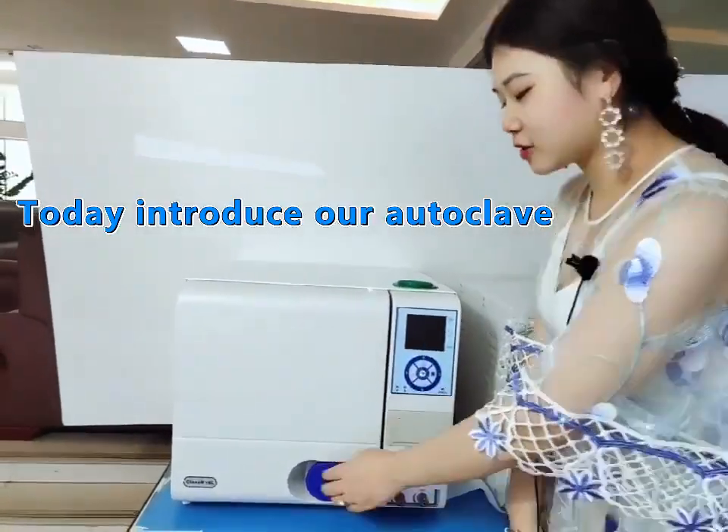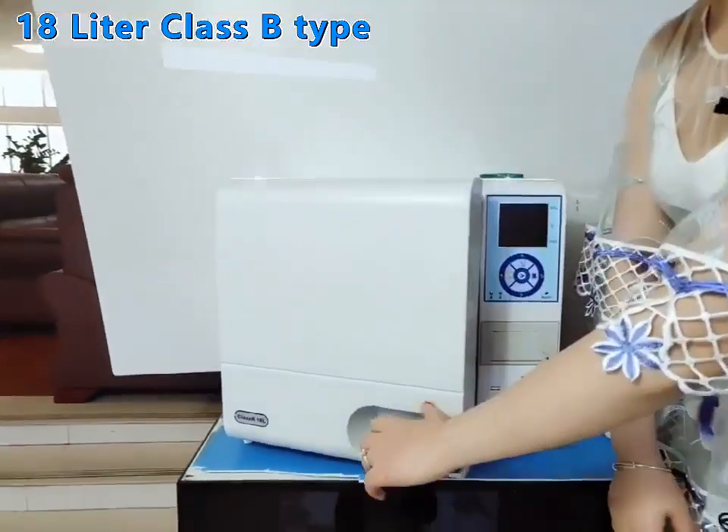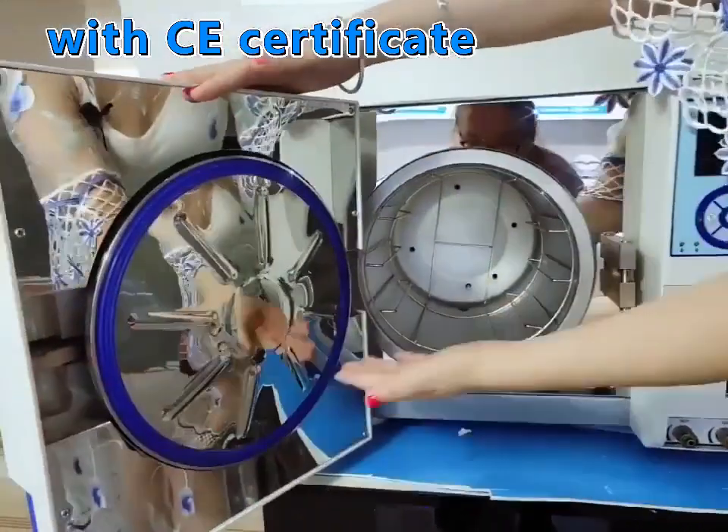Hi everyone, today I will introduce you Argento Autoclave 18L B-Class with CE Certificate.